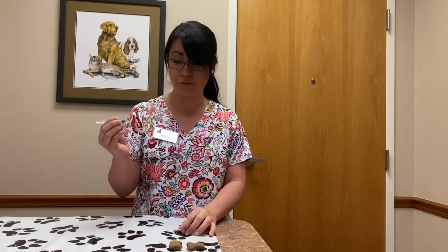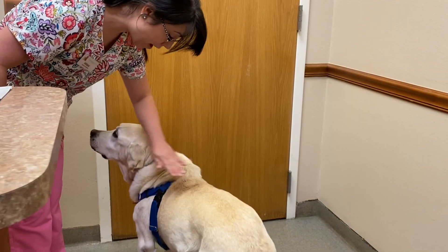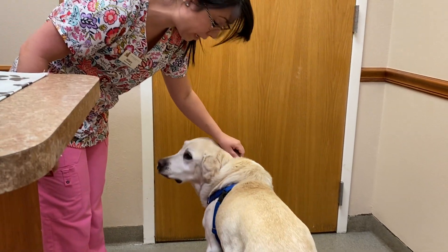When actually giving the injection, pull off the cap and have your finger on the plunger ready to go. Don't push down too hard before you're ready to administer it, so you don't expel the liquid prematurely. You're going to use the area on the back of the neck and between the shoulder blades.